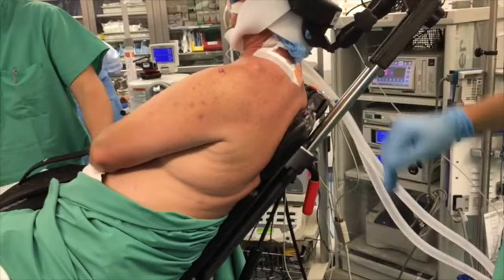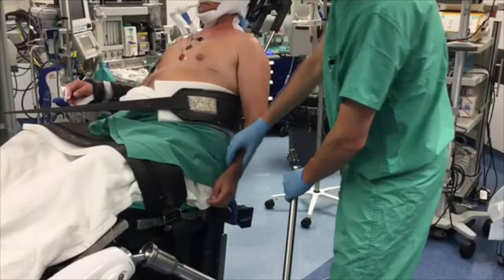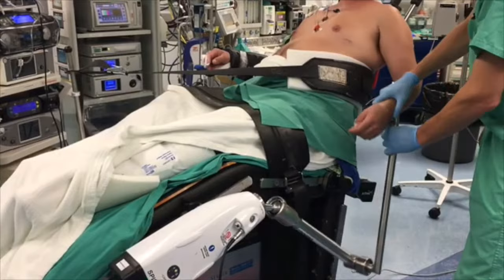The back padding on the operative side of the table is removed to expose the posterior shoulder. A final strap is placed over the ipsilateral abdomen and pulled taut to the contralateral lower limb post, with a piece of foam padding between the skin and the belt to assure the abdomen does not obstruct any intraoperative positioning. The Spider II limb positioner made by Smith & Nephew is fixed to the ipsilateral side of the operating table. It is important to assure the position will allow full range of motion intraoperatively.